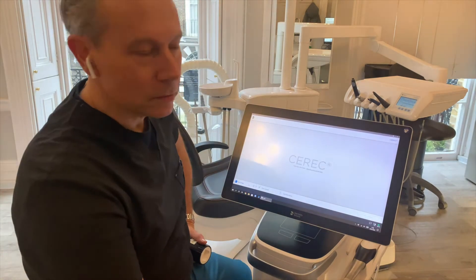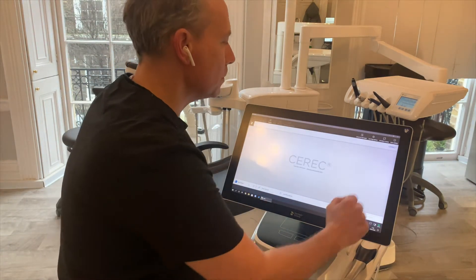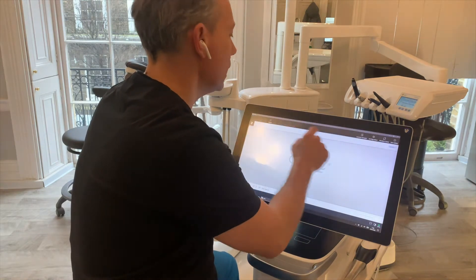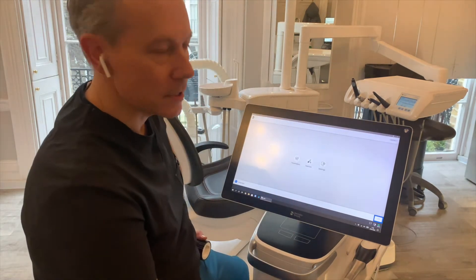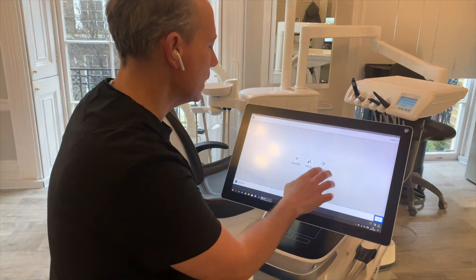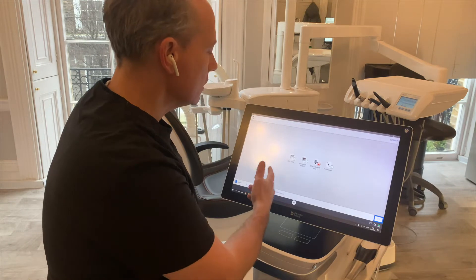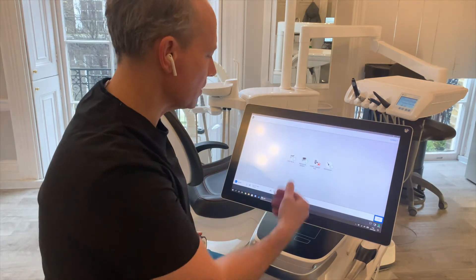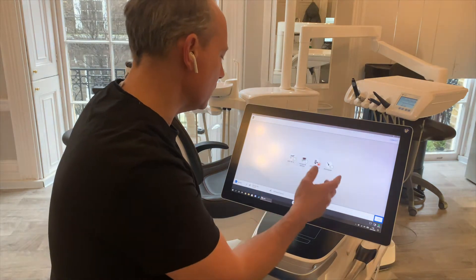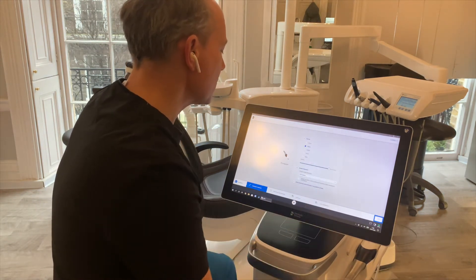You start it up as usual and you get to the familiar start screen. Go to the service menus at the top and select configuration. This is where you can do your settings and parameters and also importantly go to devices. On here you'll see a list of all the devices that are currently switched on and present on my system. I've got a couple of milling units, Speedfire, and importantly this PrimeScan. So we go into PrimeScan settings.